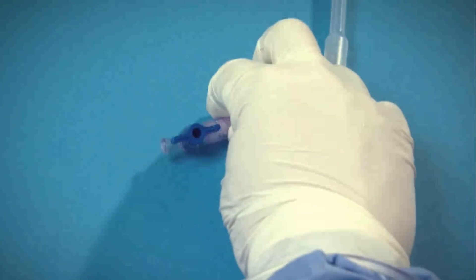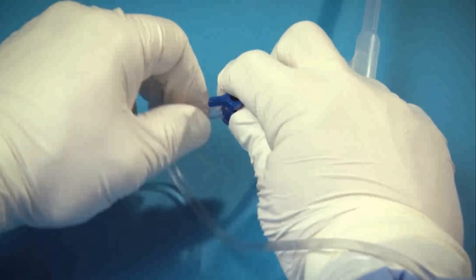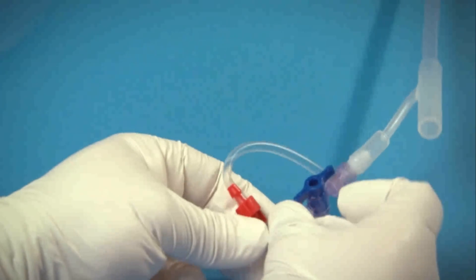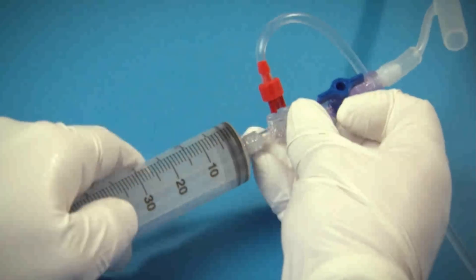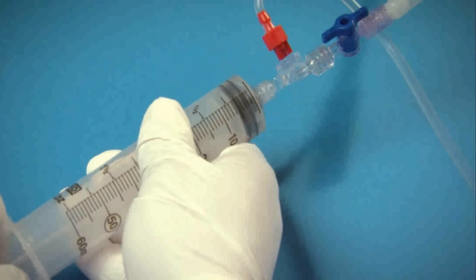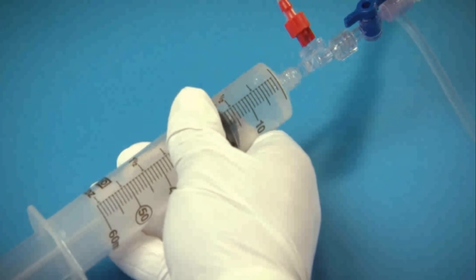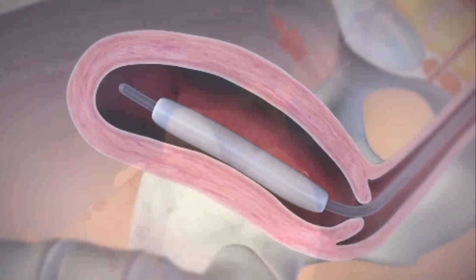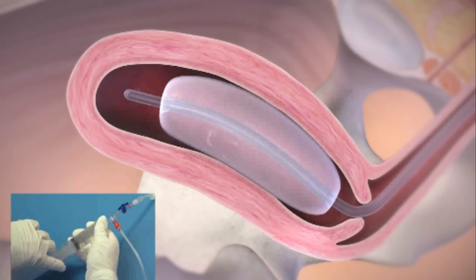Once assembled, attach the three-way valve to the inflation port of the Bakri balloon. Then attach the syringe to the remaining port on the three-way valve. Now you can begin to inflate the balloon. Pull back on the syringe to fill it with saline directly from the IV bag.